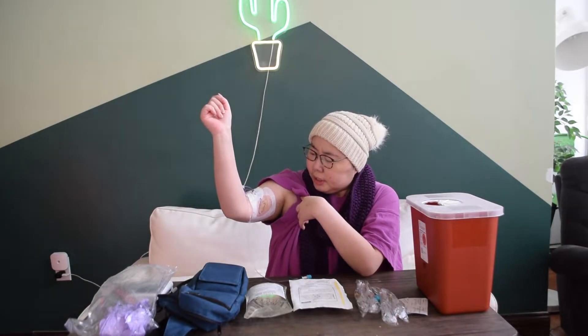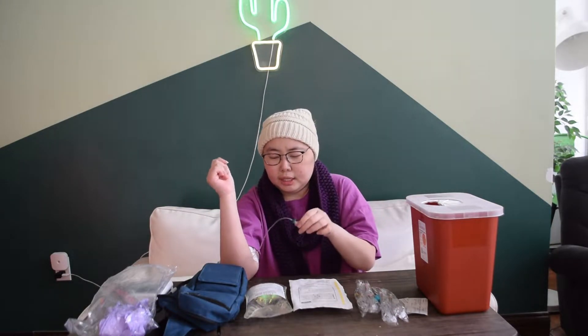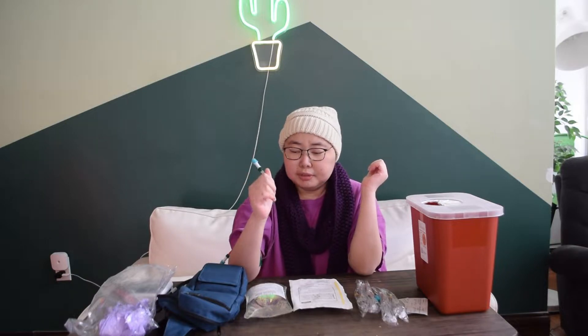I also have a PICC line — if you can see — and basically it's like a tube that goes through my arm to my heart, and it's always there. That's how I'll be giving myself the infusion.